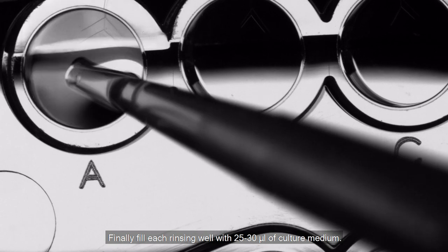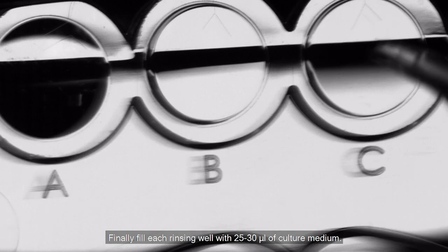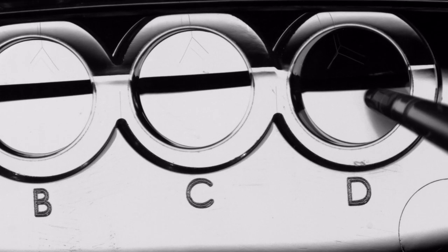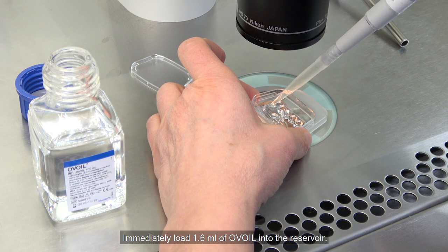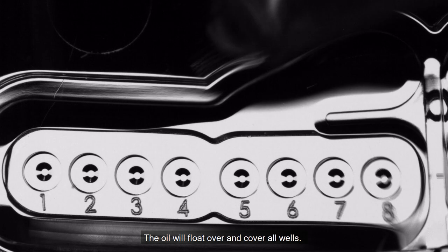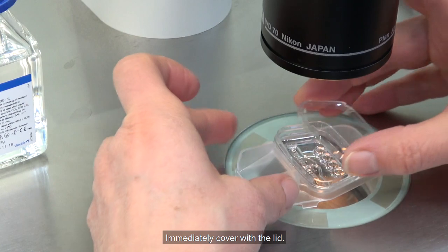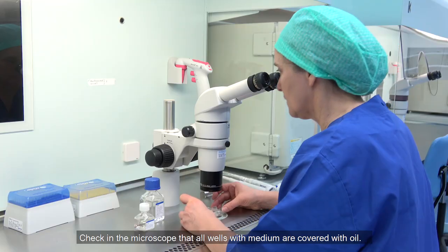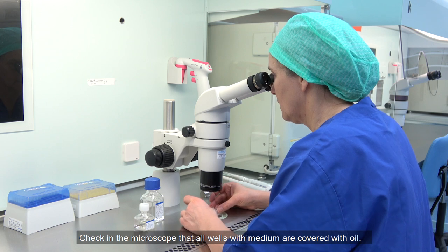Finally, fill each rinsing well with 25 to 30 µL of culture media. Immediately load 1.6 ml of oil into the reservoir. The oil will float over and cover all wells. Immediately cover with the lid. Check in the microscope that all wells with medium are covered with oil.